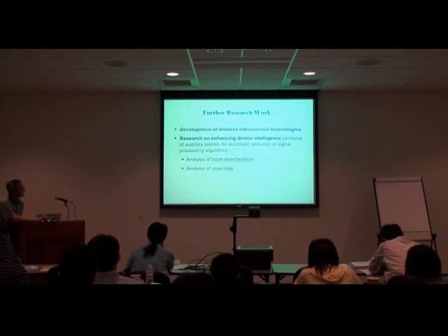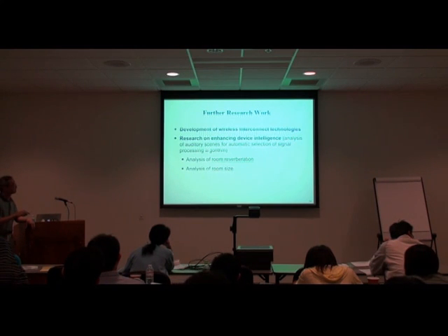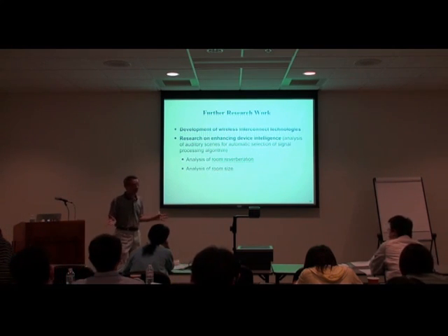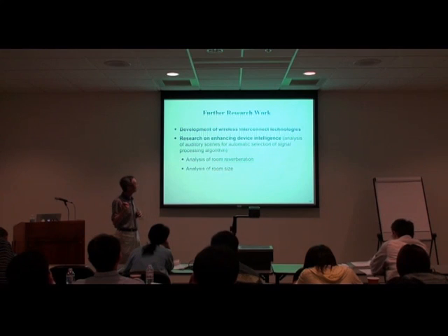And then we realized that actually the listening conditions vary from time to time in different room sizes. So we need to have a way to analyze the auditory scenes for automatic selection of signal processing algorithm. So really, when you are talking to somebody in a quiet room, you don't want to have this signal processing scheme, because I think simple amplification would do.